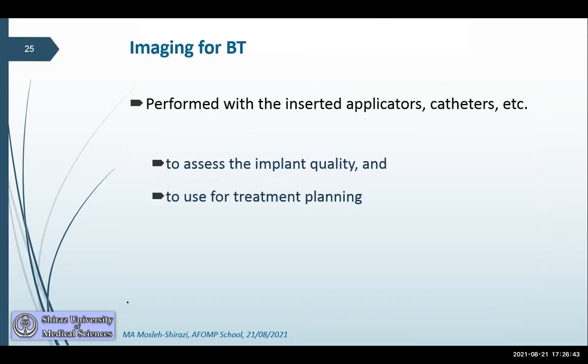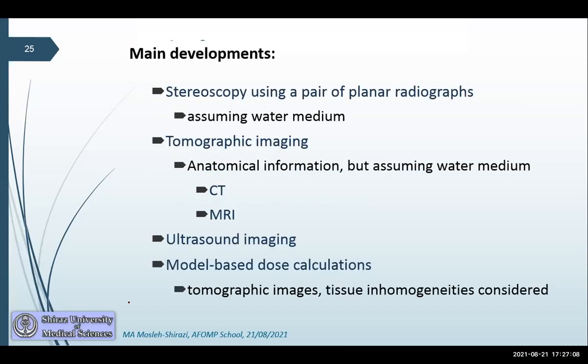Onto the use of images. Well, why use imaging? What purpose? Imaging is done, of course, with the applicators inserted in the patient to show the treatment, and that's used first to assess the implant quality, whether the implant has been done properly, and also to use the pictures in treatment planning. So some main developments, of course, there were the old pair of planar radiographs, AP and lateral, in a stereoscopic type of geometry. Of course, we assumed homogeneous water.